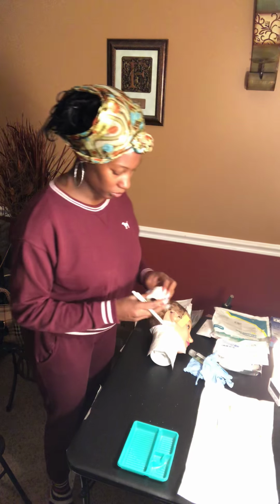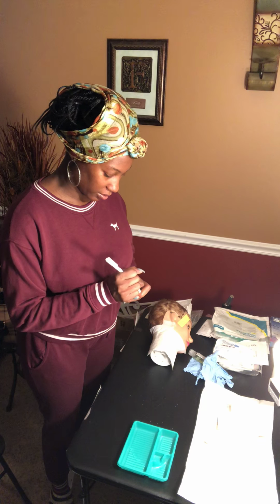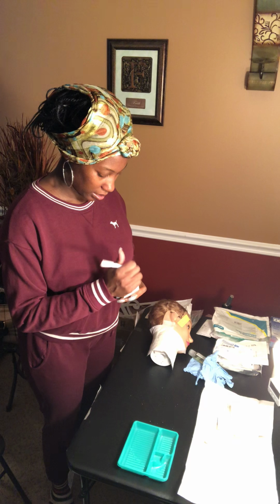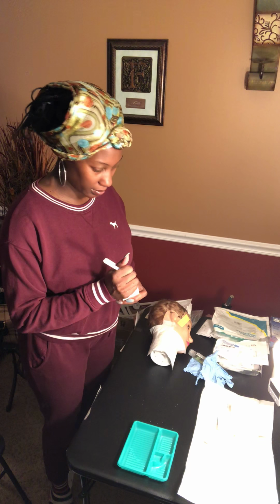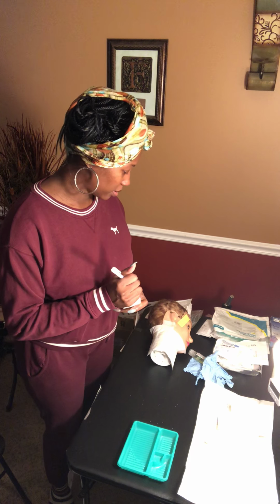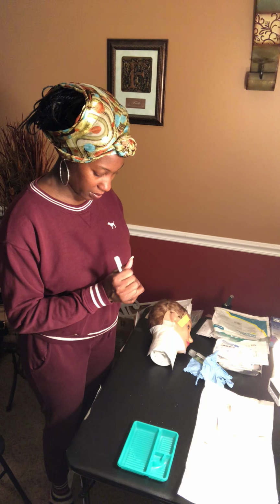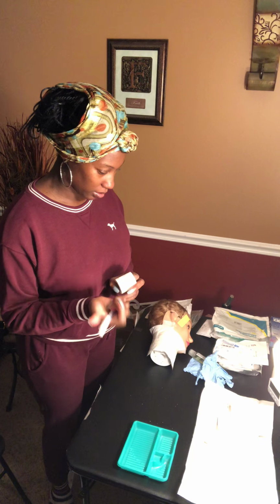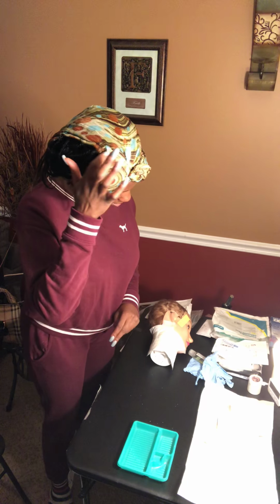I'm also going to go ahead and date it, 10/2/18, my initials, and the time. What time is it? I don't know what time it is. I'll just say 8 p.m. So that's done. When I get ready to put that on there, oh, it's already done.